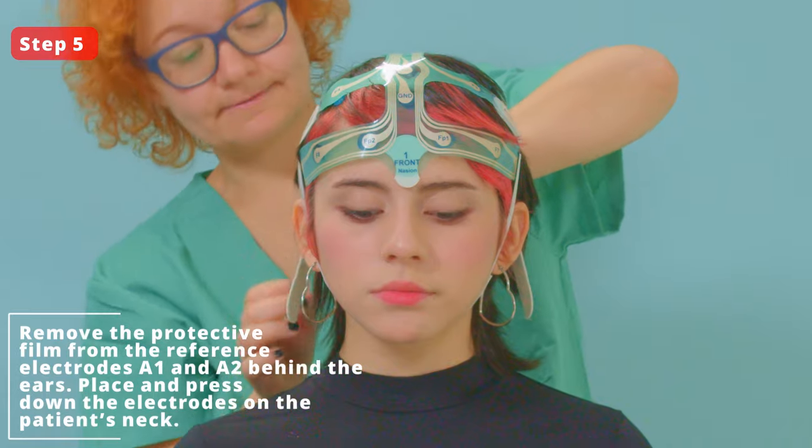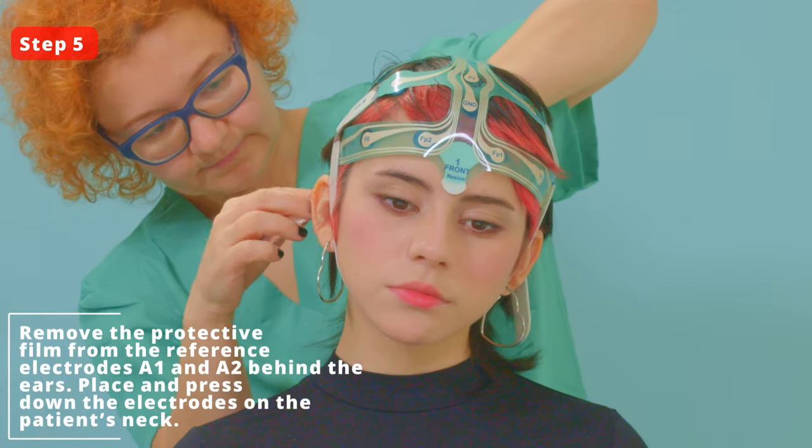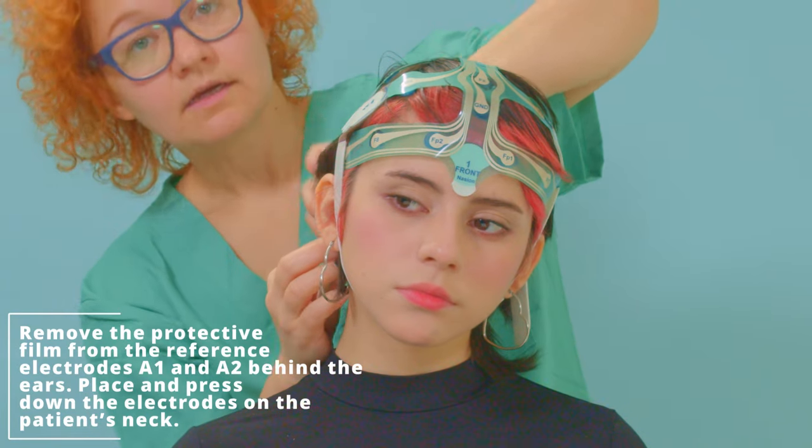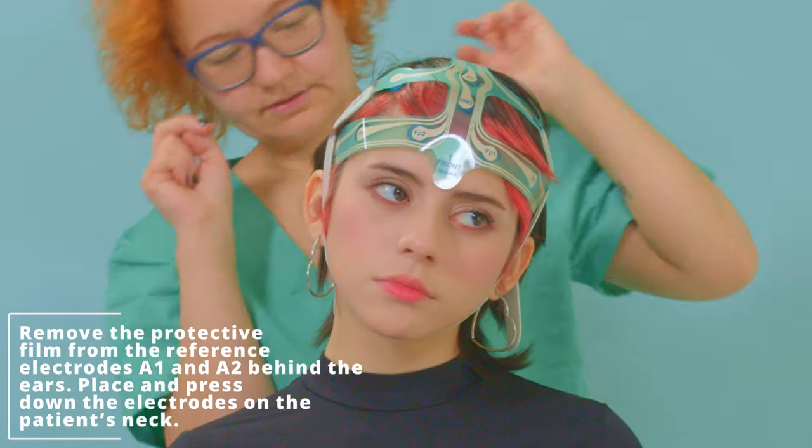Step 5. Remove the protective film from the reference electrodes A1 and A2 behind the ears. Place and press down the electrodes on the patient's neck.